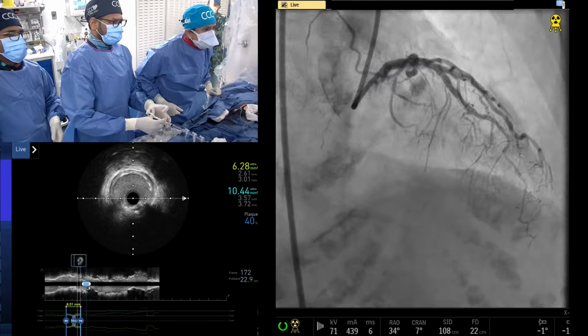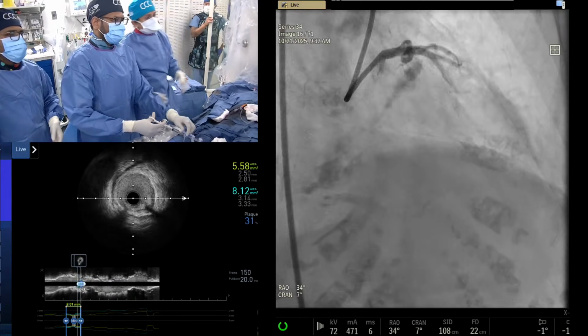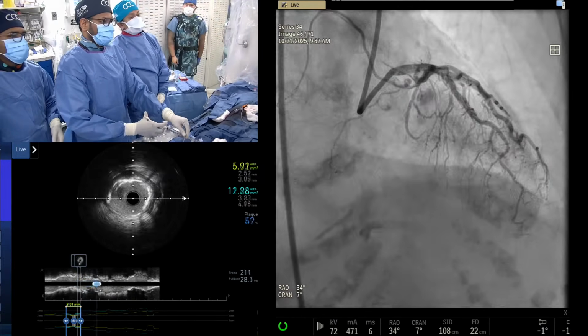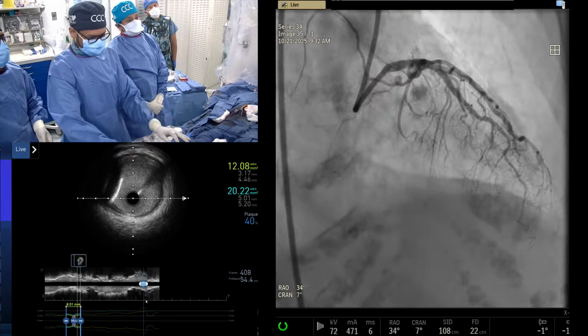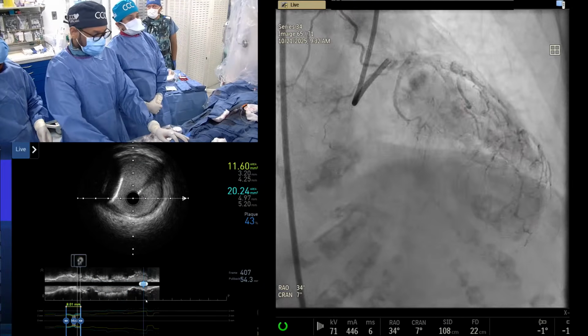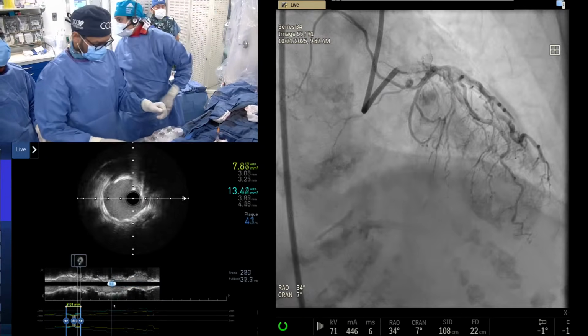Yeah. It looks very good here. Angiographically will do nothing. At the end, IVUS wins. Yeah. The other part, stent is well expanded. Proximal looks opposed, so well expanded. All right. Very well expanded.